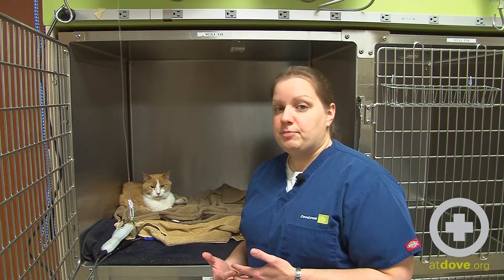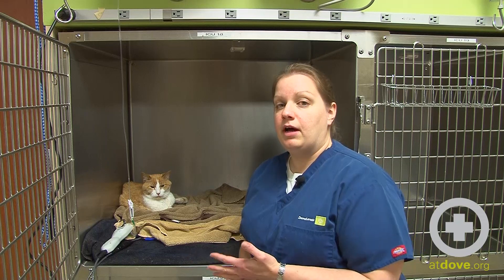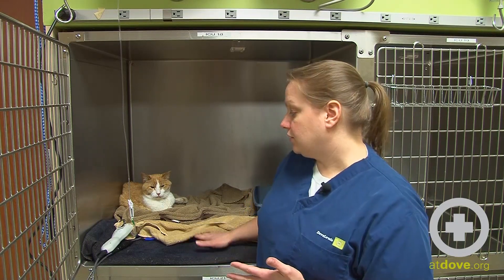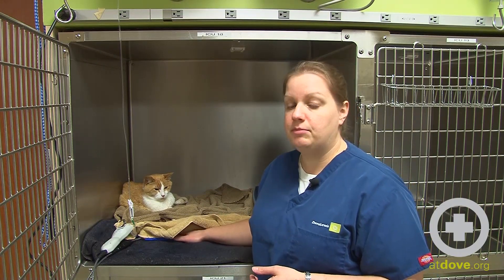There are also products that you can buy that are made specially to keep animals warm. We utilize a lot of bear huggers here, and there are also cage pads that can keep the animals warm.